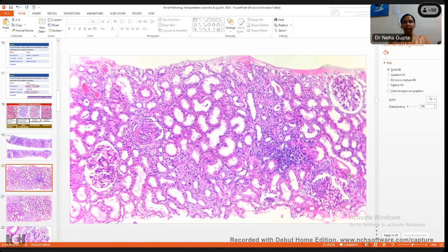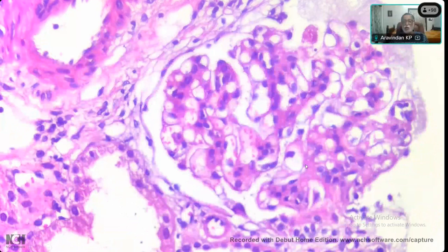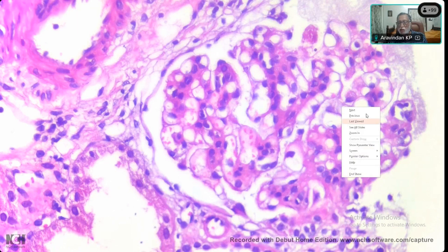Here again you find segmental sclerosis. Yes, sir. Another glomerulus here, and here, one large glomerulus. How do you describe this? So in this glomerulus, we can see capillary loops are patent, and the mesangium shows 4 to 5 mesangial cells, indicating mesangial hypercellularity, and the Bowman space is clear. That's the point. See, this is mesangium here.